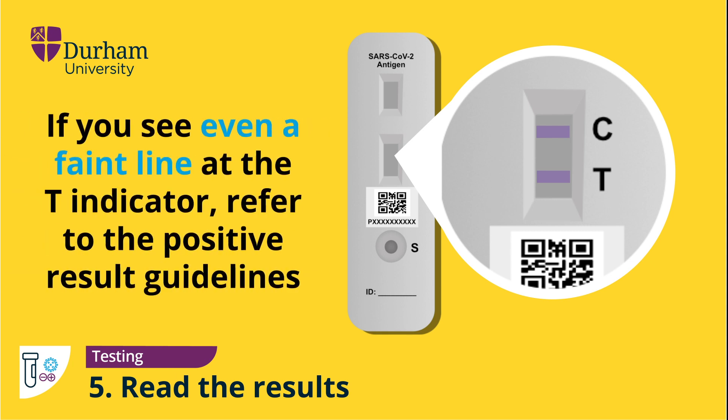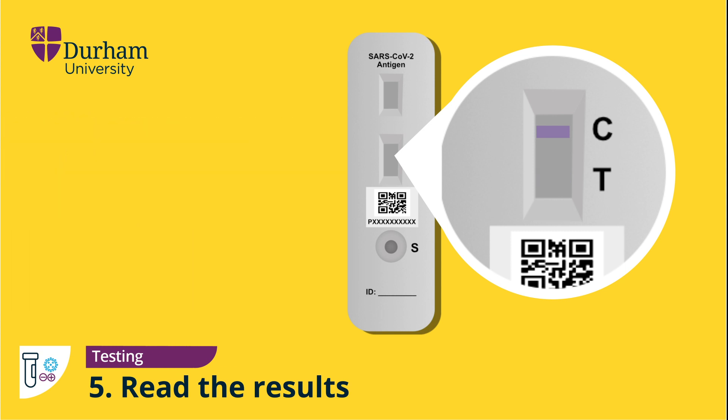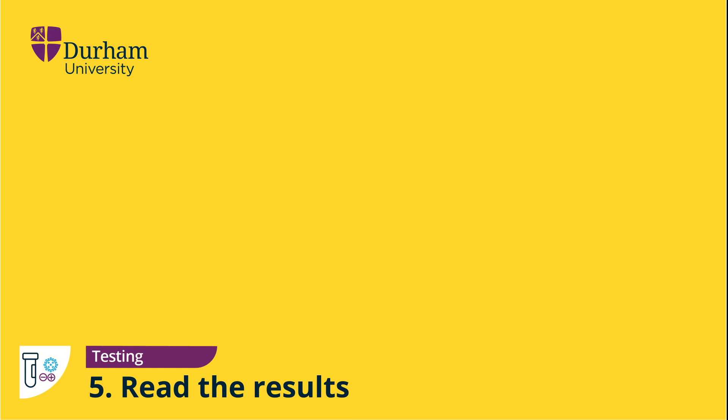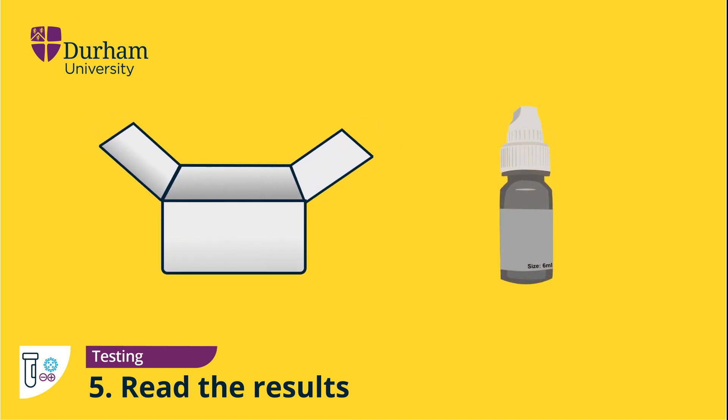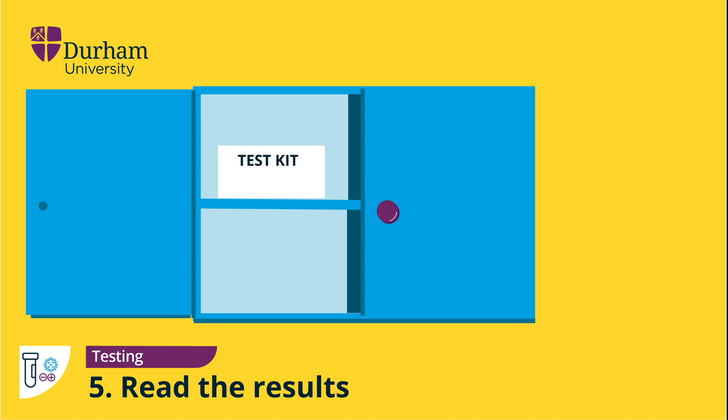If you have received a positive result, please refer to the positive result guidelines for further instructions. If there is no line on the testing device marked T, then this is indicative of a negative COVID-19 test result. When finished, return the extraction solution to the testing kit for other people to use, then place the used kit contents in the disposal bag provided and follow the disposal instructions. Store the remaining contents of the self-testing kit in a dry place free from direct sunlight, such as a kitchen cupboard.